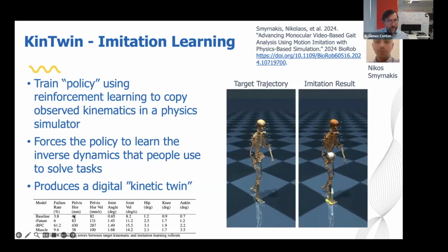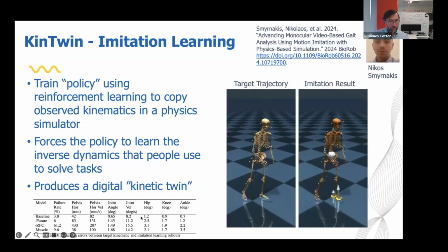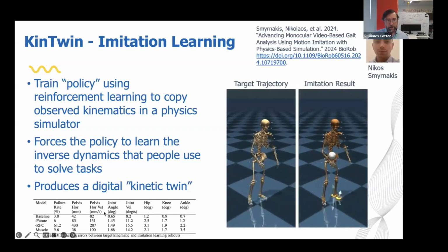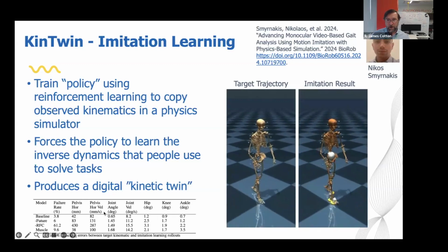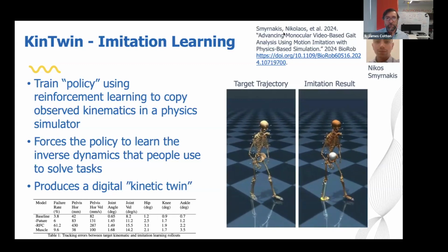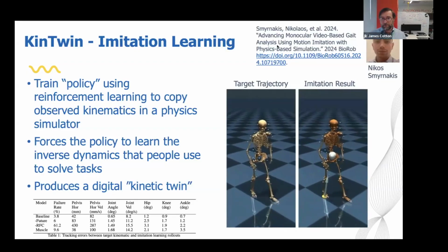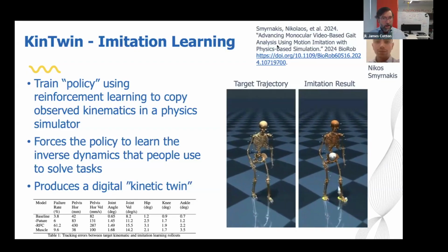And we find that the tracking accuracy of our system is really quite good. We're tracking within a couple of degrees for most of the joints. Speed is quite good. Now, there's details we need to tune up with some of the ground contact interactions, but I'm excited about this because we've seen, especially from smartphone in the past, that when we put these physics models into the inference process, it can really improve our accuracy.